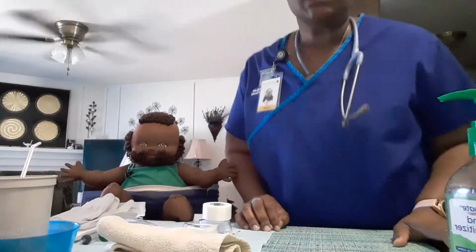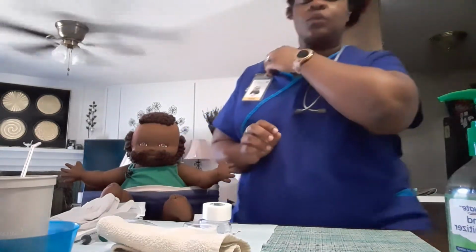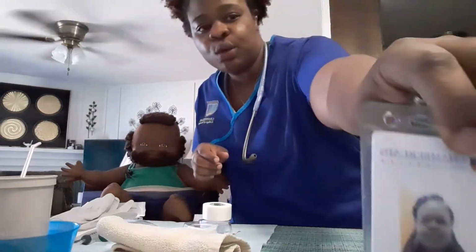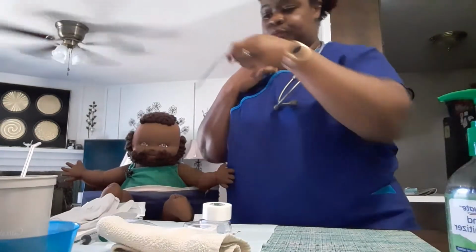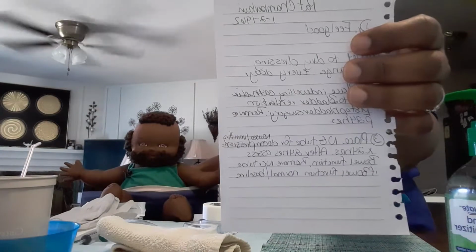Okay, so this is Amelia. I am doing my check-off for nasogastric placement and removal. This is my patient, Mr. Chamberlain. I have an order to place an NG tube.